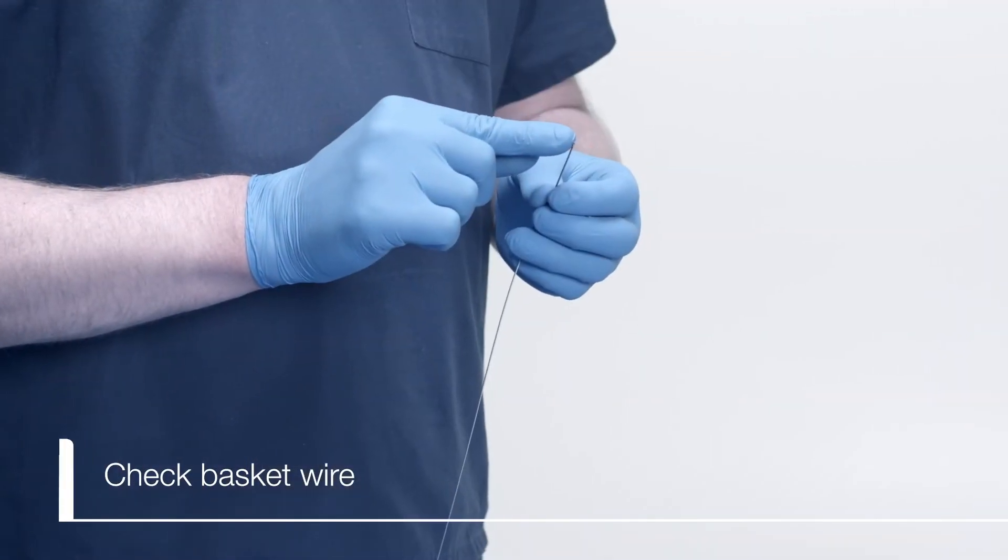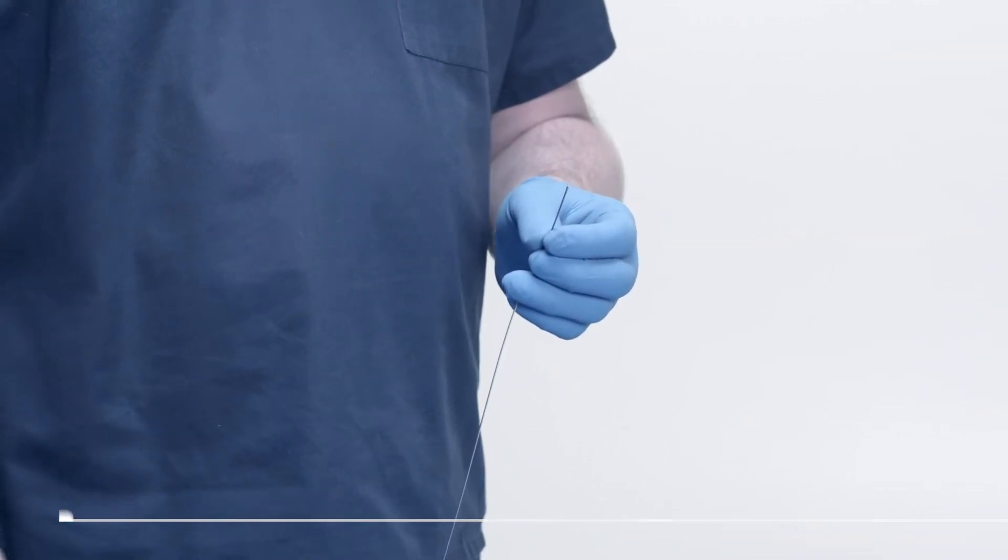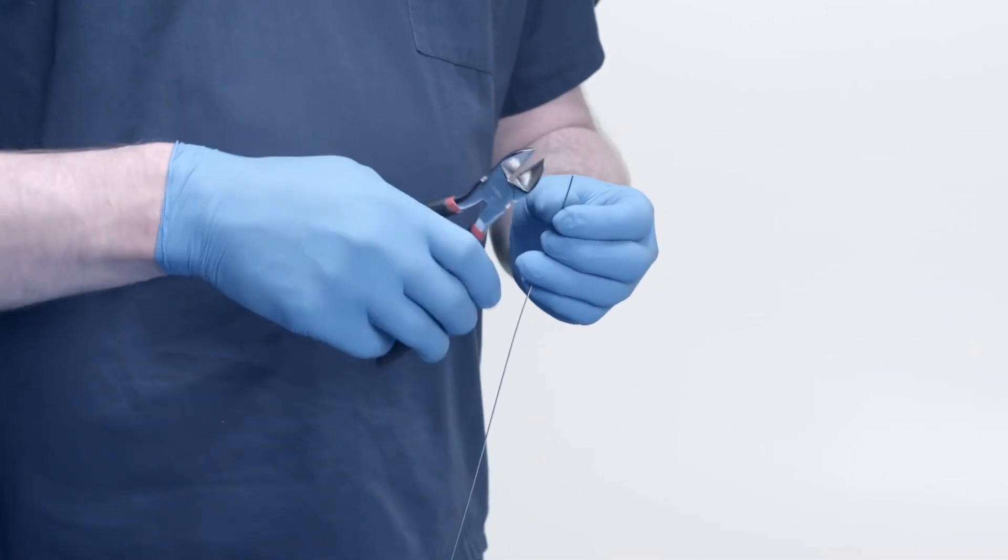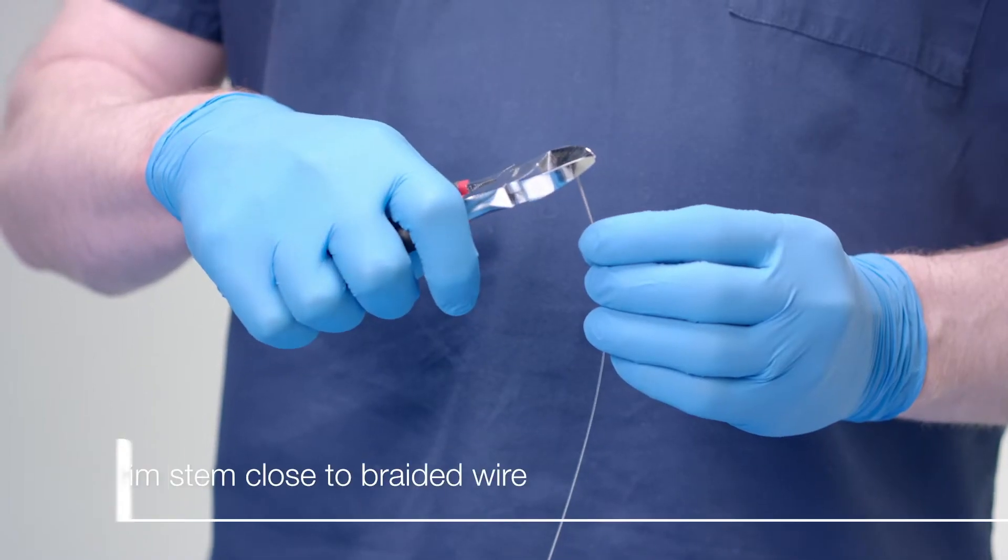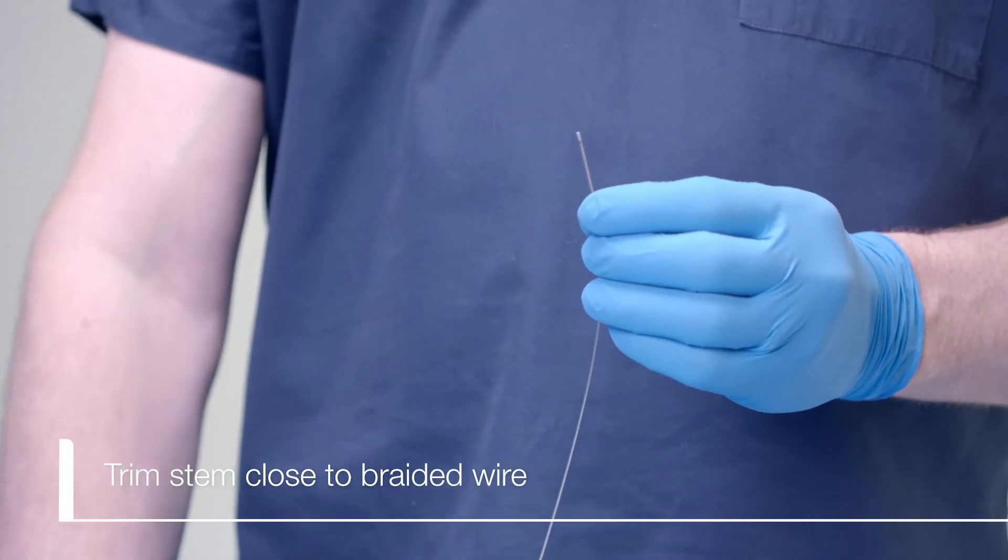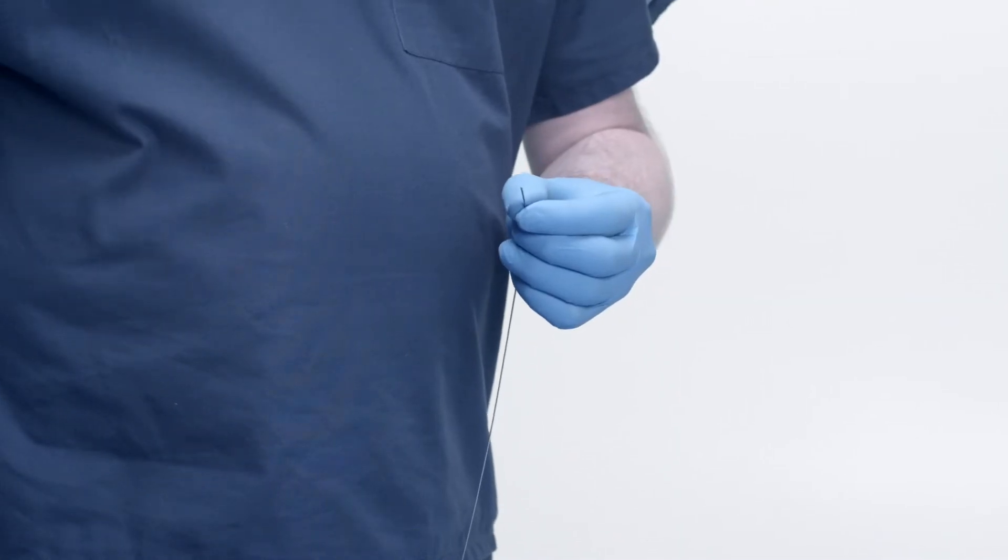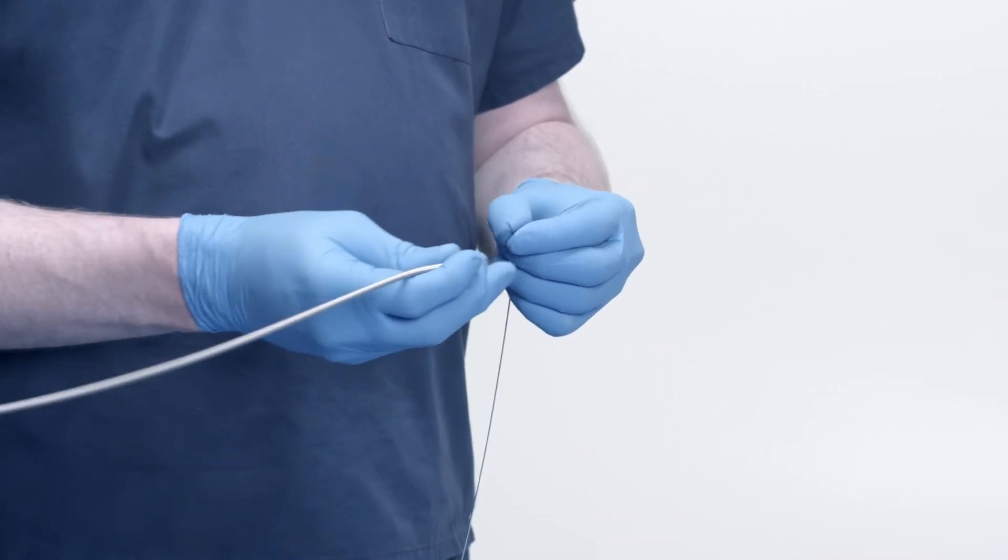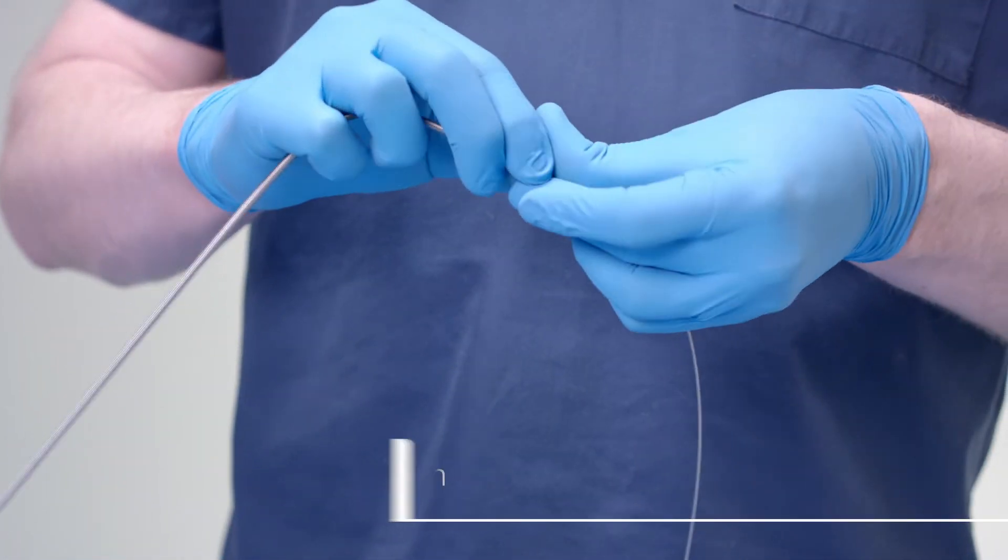Now you should see the remaining stem connected to one braided wire hanging from the patient's mouth. Trim the remaining stem close to the braided basket wire with the wire cutters. If too much of the stem is left, then it will not smoothly pass through the emergency Lithotripsy coil sheath.